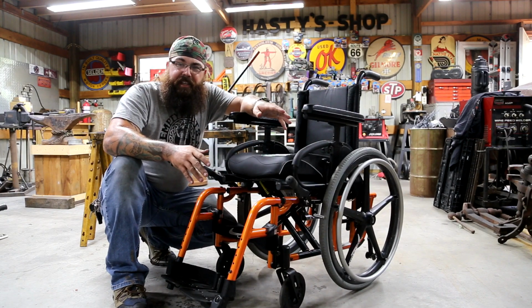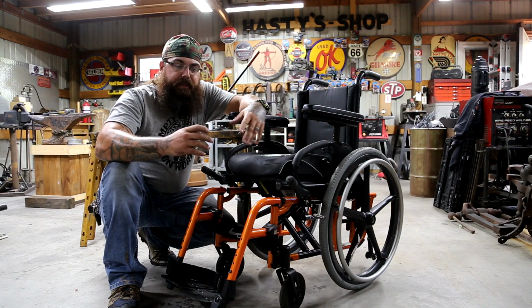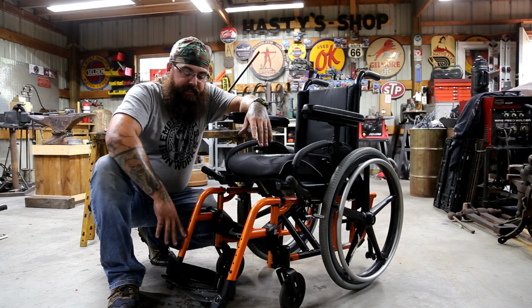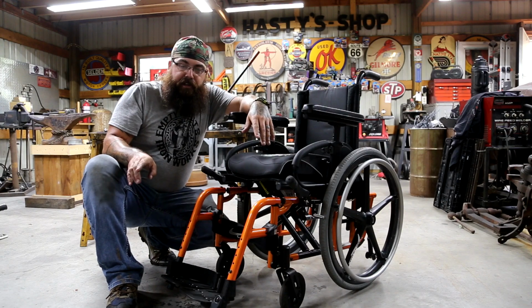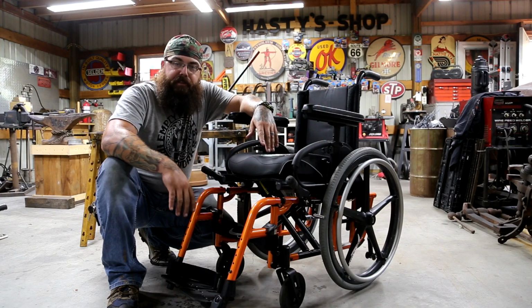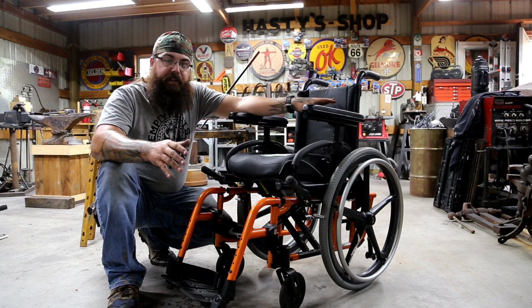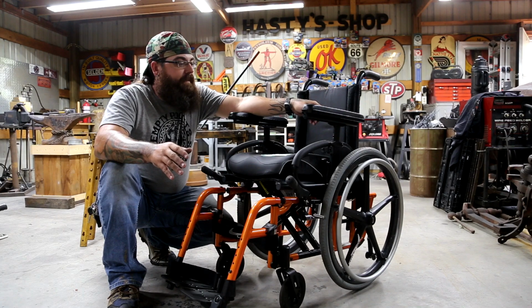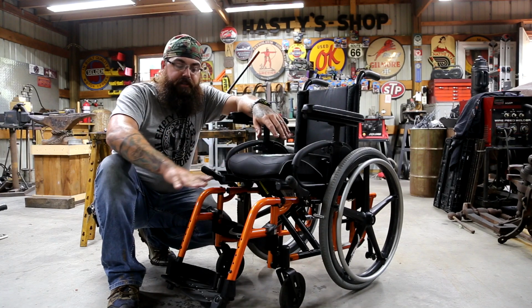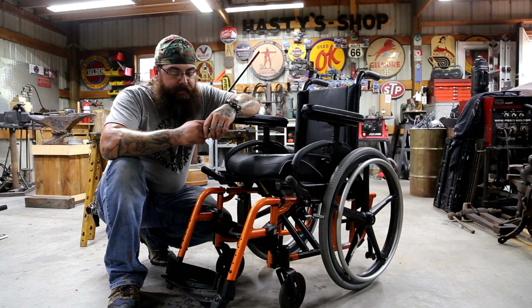I had to almost sneak it out of the house to do what I need to do to it. I bought some hardware and some nylon washers so that there's no scratching of the paint. I basically want to build a bracket that comes up with a shelf that comes out, put a wood platform on it, probably paint it black so that it matches the chair. He has a seat cushion that came off of this chair before they grew it, and I saved it. So we're going to utilize that on the top of this to give him a nice platform so that he can sit comfortably and utilize his chair.